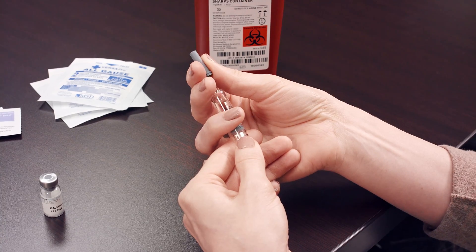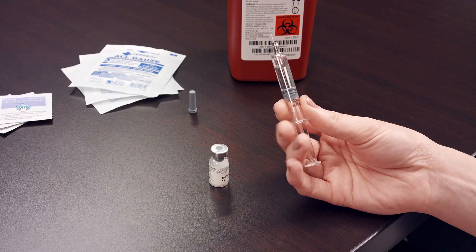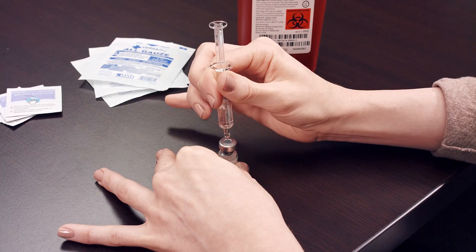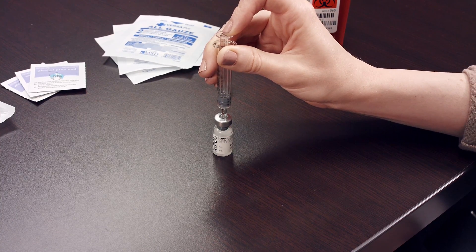Remove the cap from the pre-filled syringe of bacteriostatic water. Insert the needle into the Gonal-F multi-dose vial and push the plunger until all of the water is inside the vial. Gently mix the contents until fully dissolved.